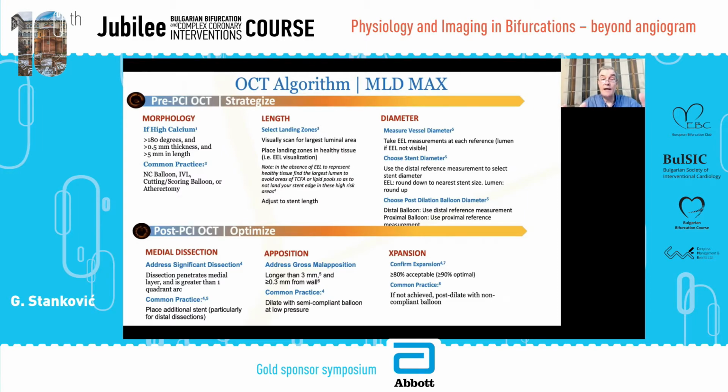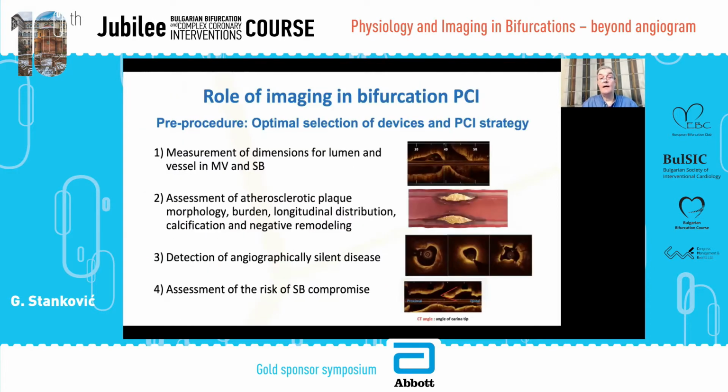Pre-procedure, we see what the length is, what the safe landing zones are, and which diameter we should safely select to achieve the optimum. At the end, we exclude medial dissections, and we are sure that we have optimal apposition and have achieved optimal expansion criteria. Together with the Japanese and Korean Bifurcation Clubs, EBC has published a series of documents.